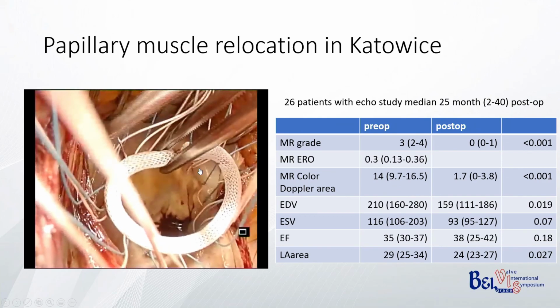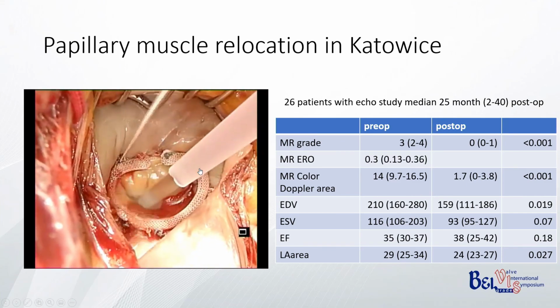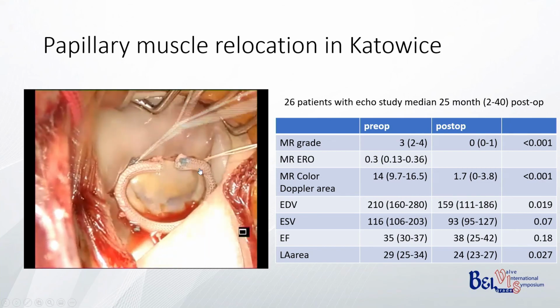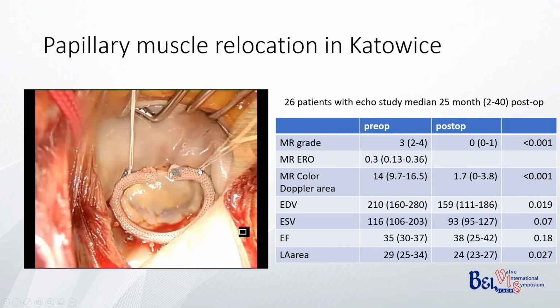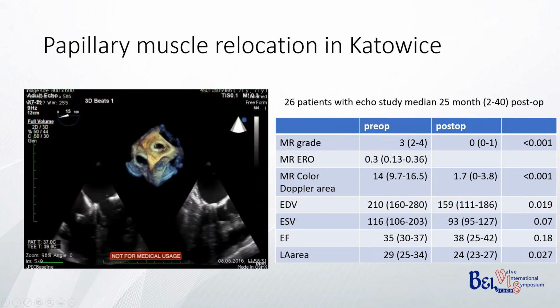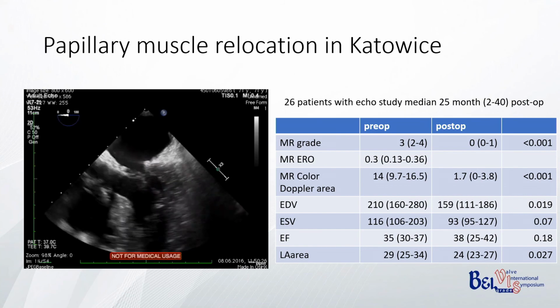And now after tying the ring down, you perform the water test, and under this water test we just tie the stitches, bringing the papillary muscles closer to the base of the heart, and you will see particularly with the next one that this will bring all the coaptation line up towards the surgeon, and this remains very, very stable. As you can see from this data, at least in those patients that we monitored, this gives perfect results.